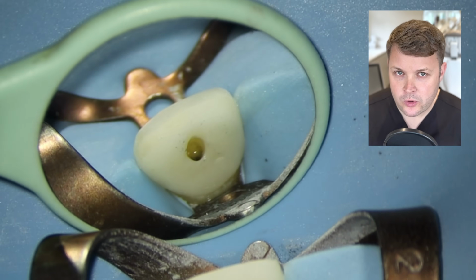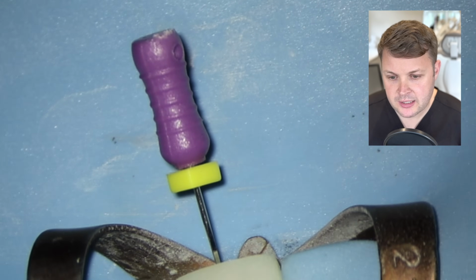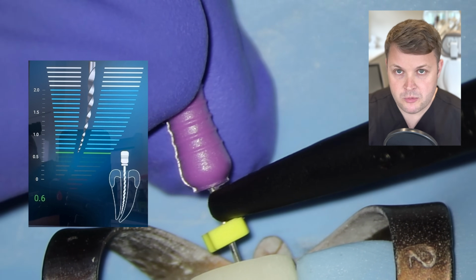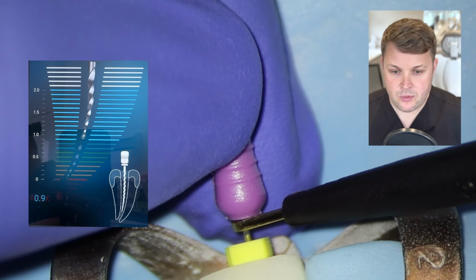So once we've removed this little ledge, I'm going to gain the working length with the size 10 K file. But what I notice when I hook up this apex locator to this file is that the readings are absolutely all over the place. Even any kind of movement, left, right, up, down, the apex locator is out, in, out, in, out, in.